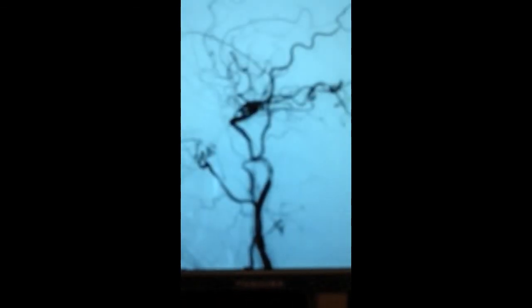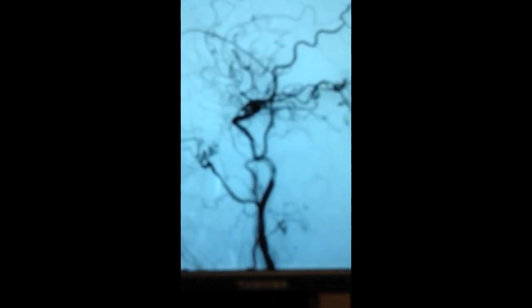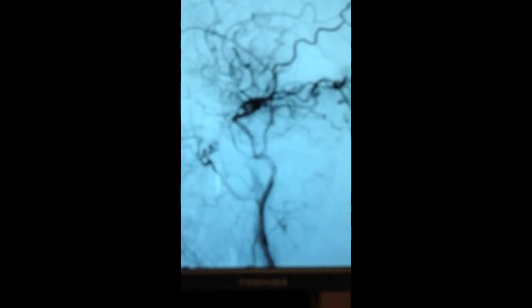Repeat arteriographic runs now show the vessel to be completely open, with filling into the brain and blood flowing through the previously occluded vessel.